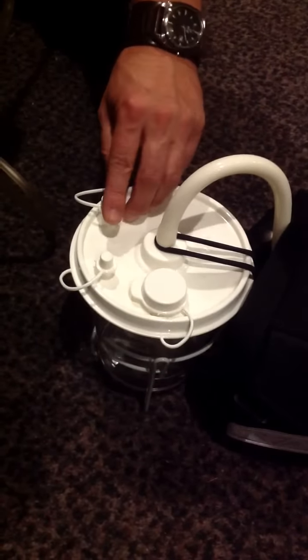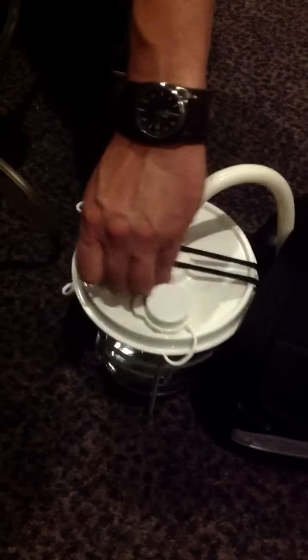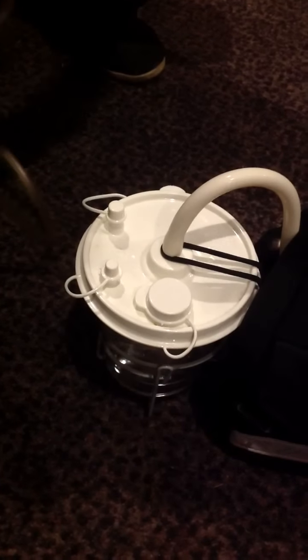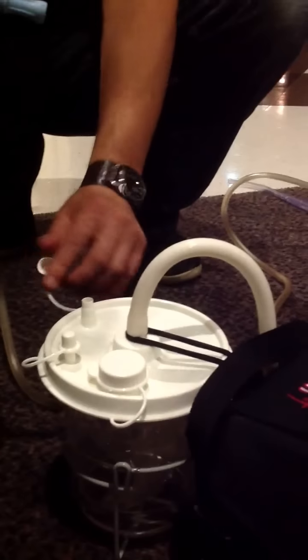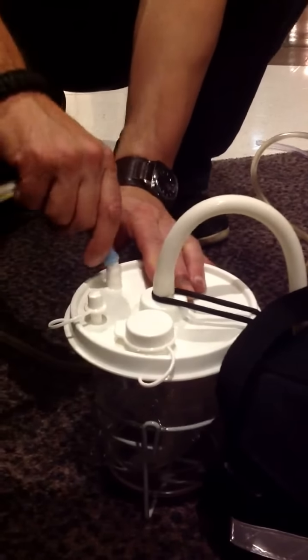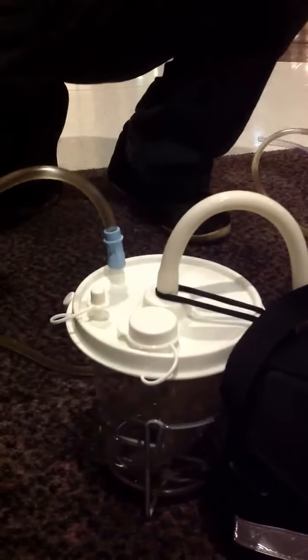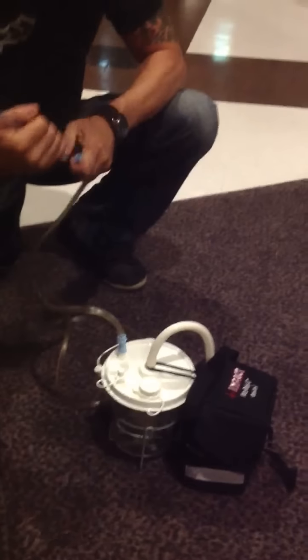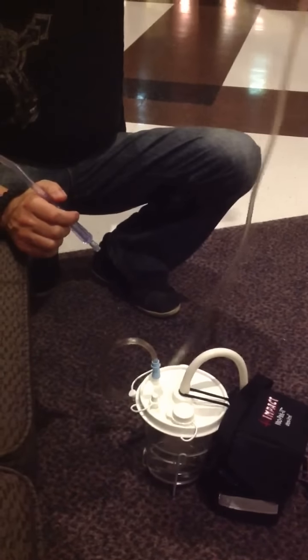You can attach additional reservoirs if there's a large amount of material that is being suctioned out. And the most necessary part is the tubing that is connected to it and going to the patient. The tubing is another important aspect of the whole suctioning process. It's important to remember not to kink it, otherwise the suction could be rendered ineffective.